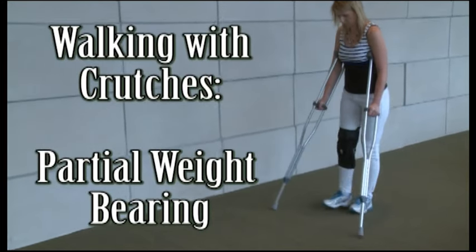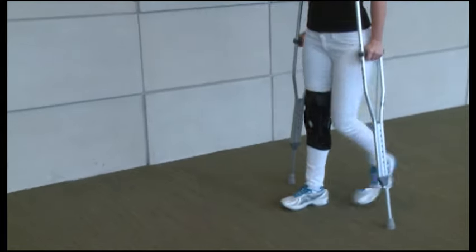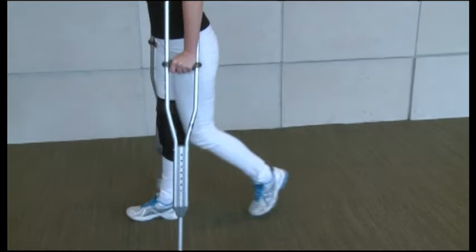Walking with crutches, partial weight bearing. It is very important to follow your doctor's orders. Place only the amount of weight ordered by your doctor on your injured leg.